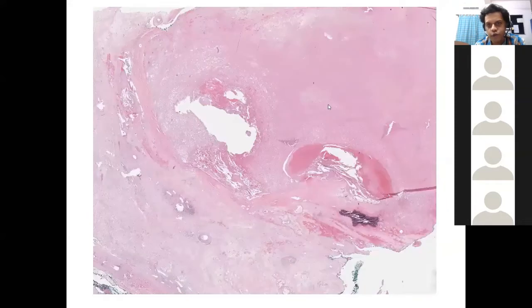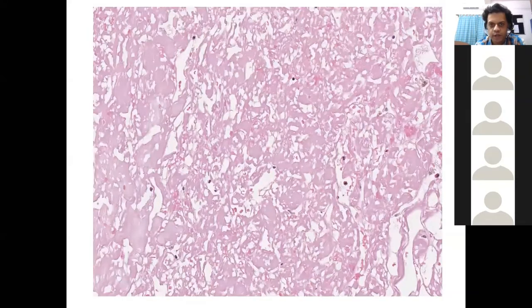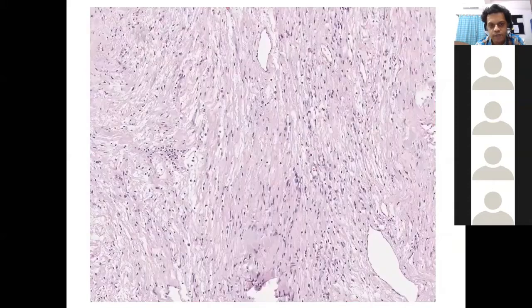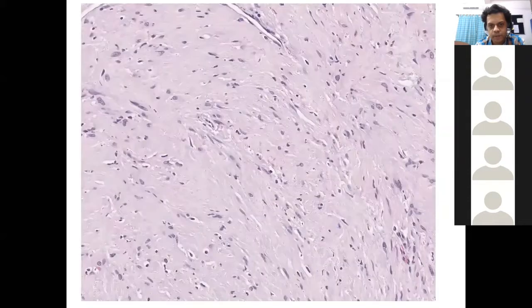You have a lot of necrosis basically, which just looks like discrete amorphous zones. You don't see the tumor cells blending into it as we have seen before, as in the case of coagulative necrosis. You don't get that. So you have just these discrete zones without any tumor cells whatsoever. And adjacent to that, you have small amounts of residual viable cells, which are again bland. Not much atypia seen over there. Very bland, innocuous looking cells.